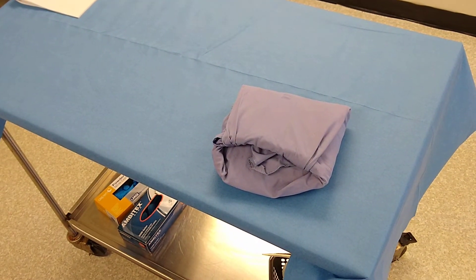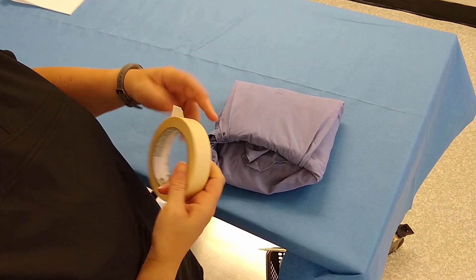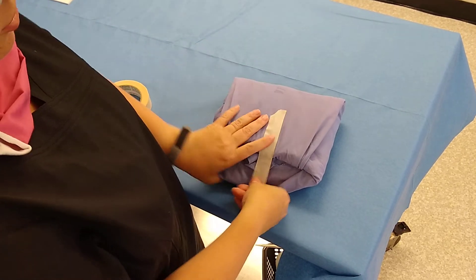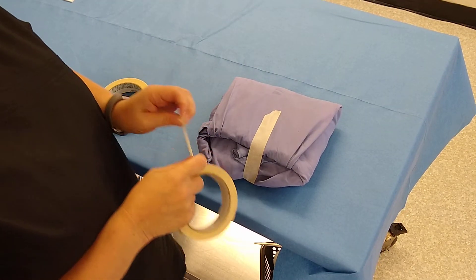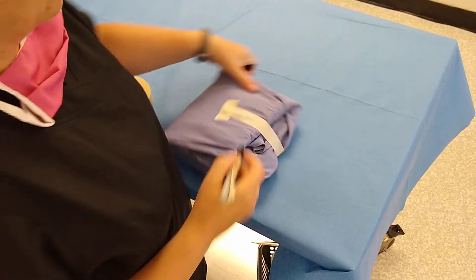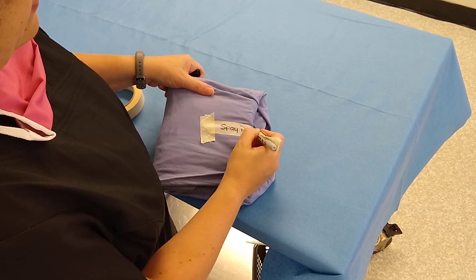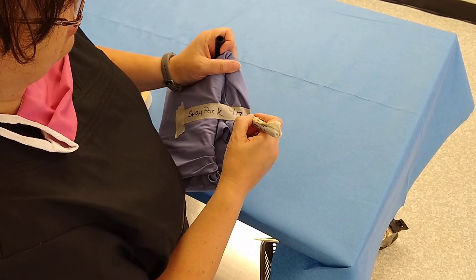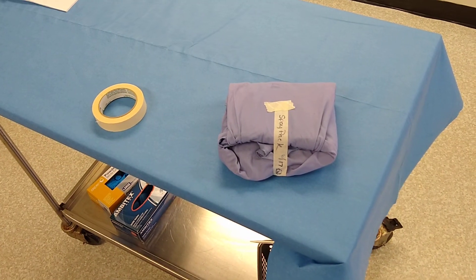Find the edge of your autoclave tape — remember, the tape is not keeping your pack together, it's just letting us know the sterile seal has not been broken. Put your autoclave tape on it and label it with what type of pack it is — in this case, a spay pack. Add the date it was autoclaved and your initials. And there is your spay pack.